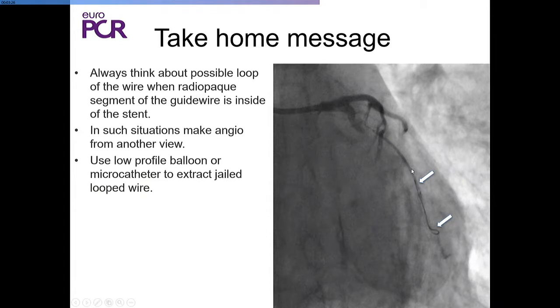But that intervention lasts 4 hours, and the patient got a huge amount of contrast because we didn't perform OCT in that case. And because we performed a control angio after that, to see what that. Okay. And then I missed it.